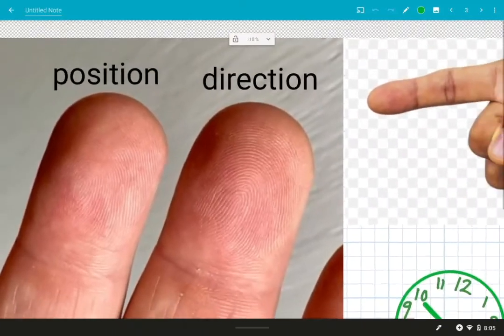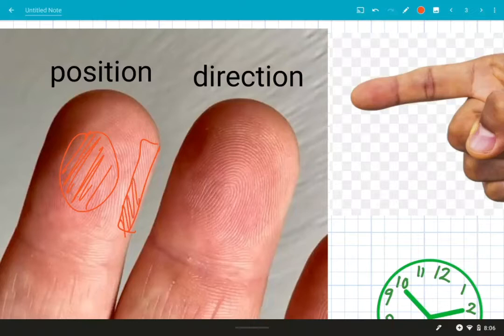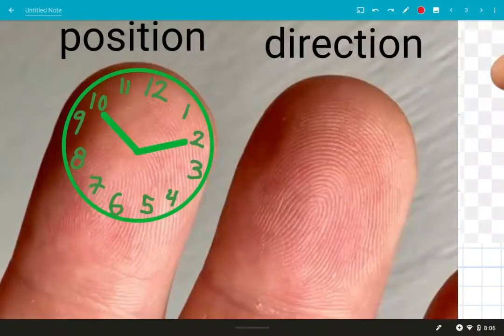When you position the lancet, you want to make sure you're putting it in the right area. What you don't want to do is put it in the center. This area is too thick. You don't want to put it on the sides either because, just like the pinky, the fat layer and the skin are thinner, and that gives you a higher chance of hitting the bone or just general pain. An easy way to remember what position you should use is to think of the finger as having a little face. Your eyes are going to be where you can put that lancet. You can also think of the tip of the finger having a clock on it, and then your puncture sites are going to be right at the tips of the arms at the 2 and the 10.